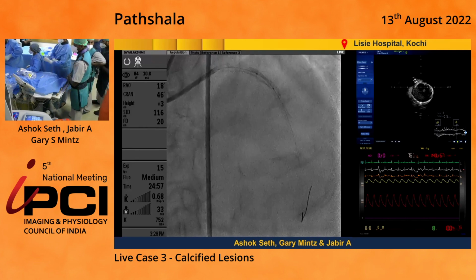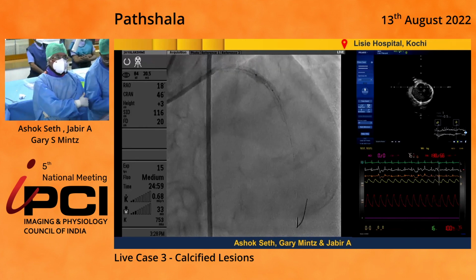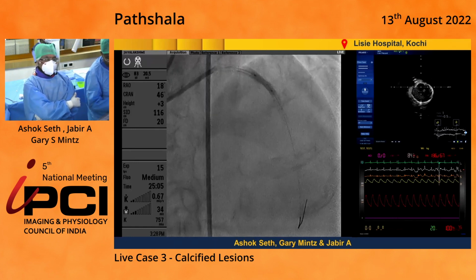Let's go up to 20. So I'm at 20, 22, 24, 26, 28, 30.